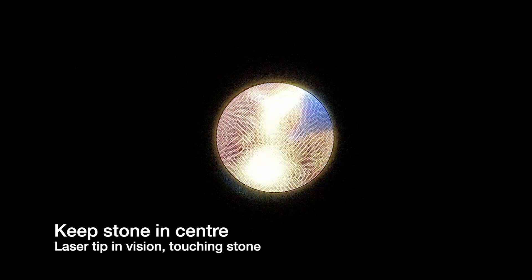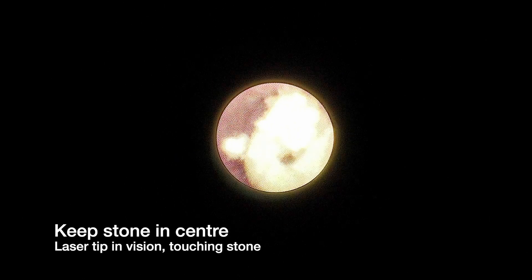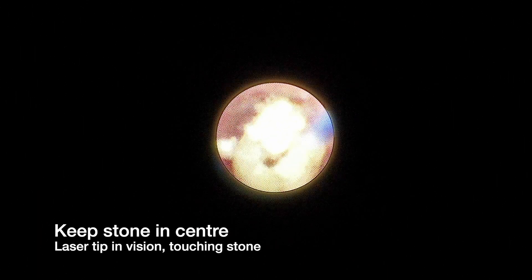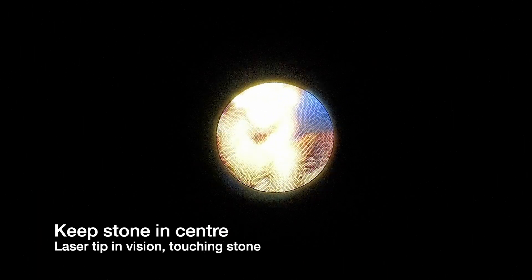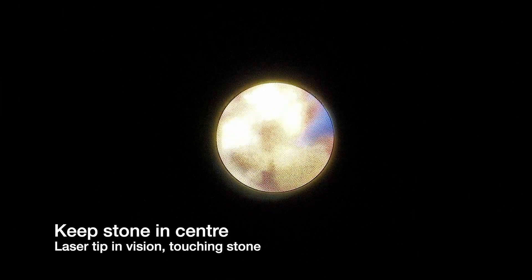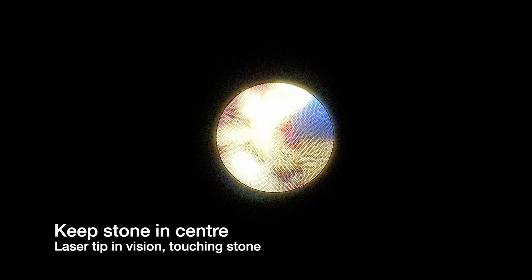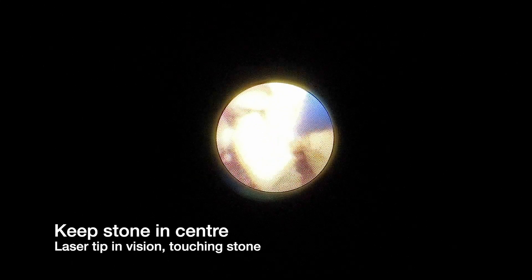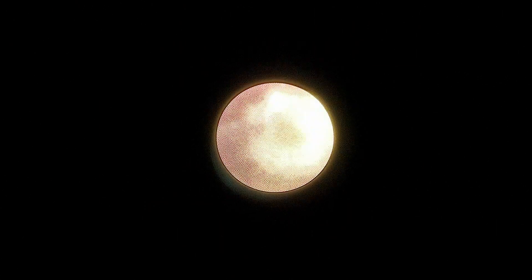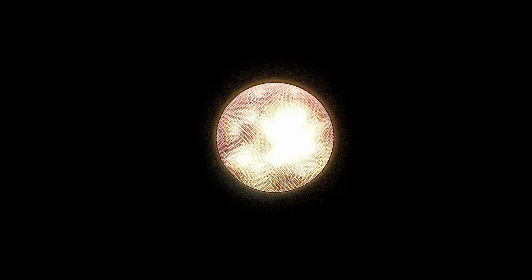The fragmentation proceeds to ensure all fragments are below at least 2 mm, or the surrounding duct diameter, to facilitate removal with a basket or forceps. We see a slight aiming beam at the center which guides the laser; however, tactile feel is a more reliable indicator that you are not injuring the duct mucosa and are directly onto the stone. The laser used in this case is the luminous holmium laser.